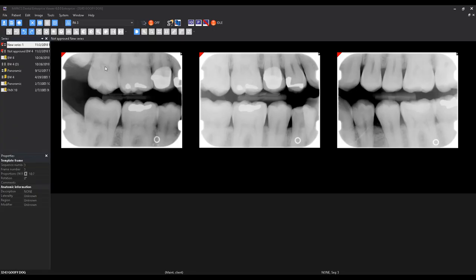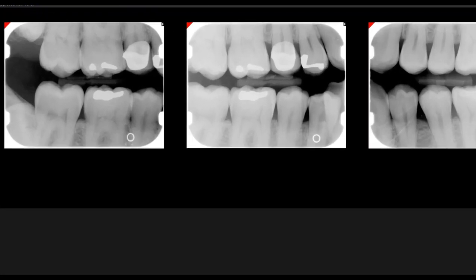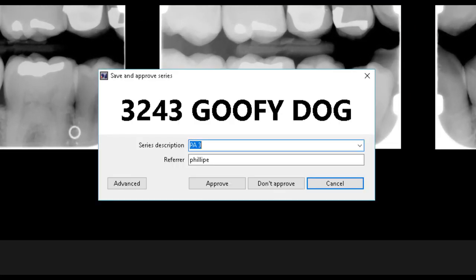When saving a periapical series, it is good practice to add additional information to the series description. This will allow users to identify more easily what is contained in a particular set of images.